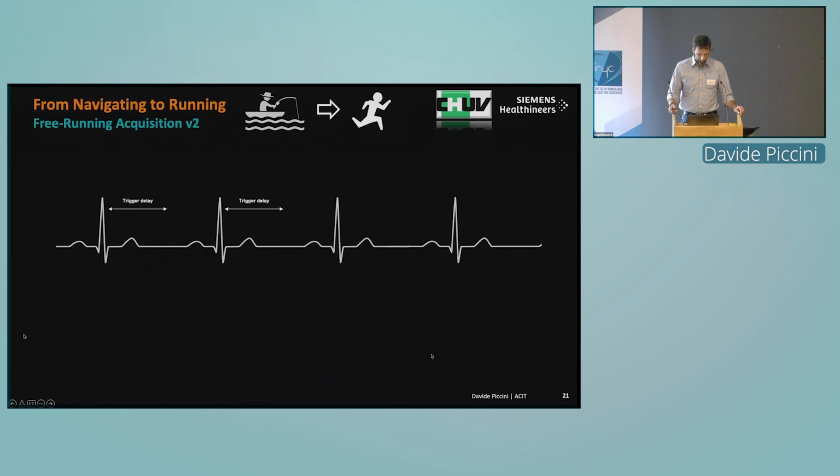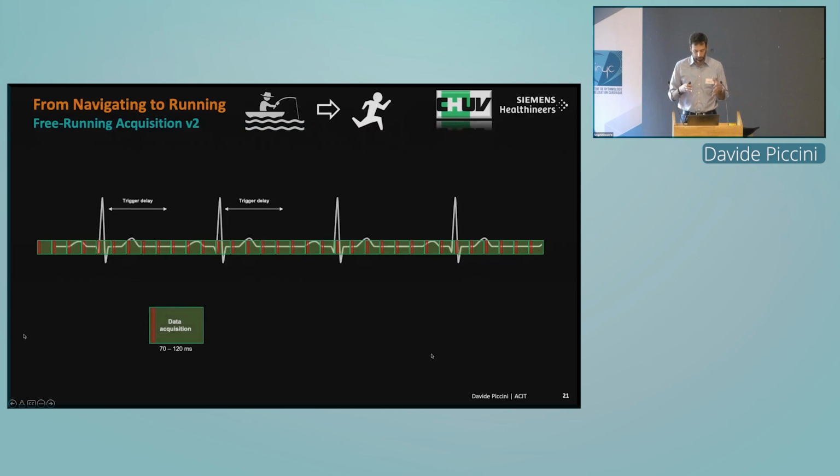And in the second version that we have now, we try to remove the fat saturation because the fat saturation doesn't behave as you would like to because there is no recovery time. So we try to encode the fat saturation capabilities in the sequence, being it a different pulse, like yesterday Xavier was showing, or being, I don't know, a Dixon approach or something like that. But then the acquisition block becomes very simple.